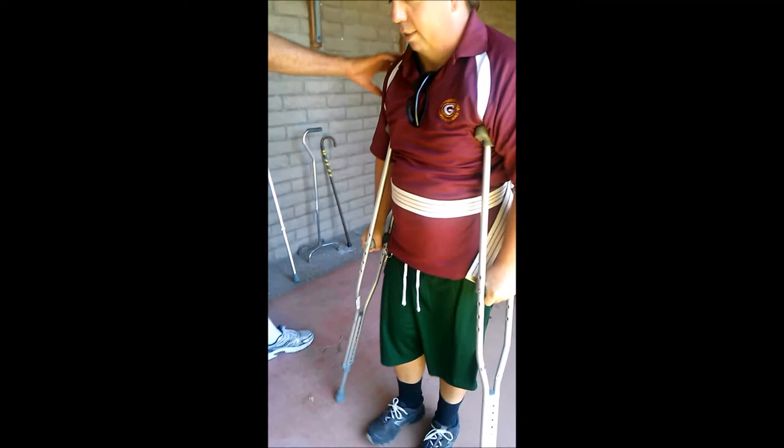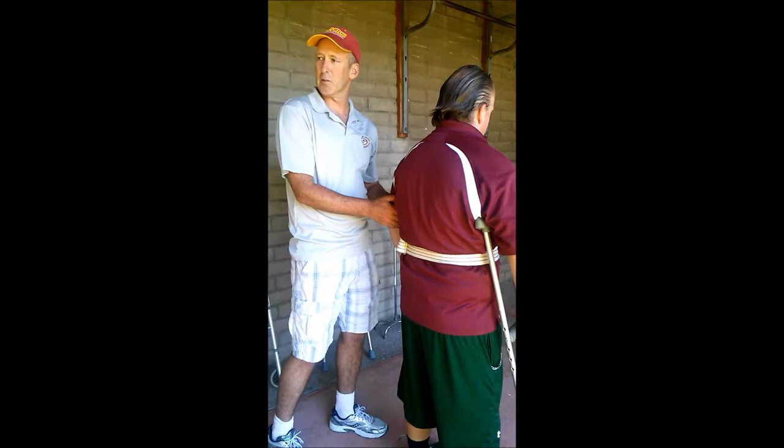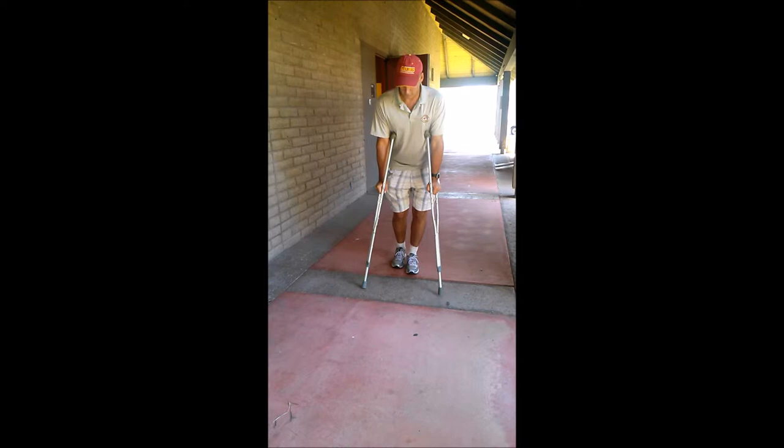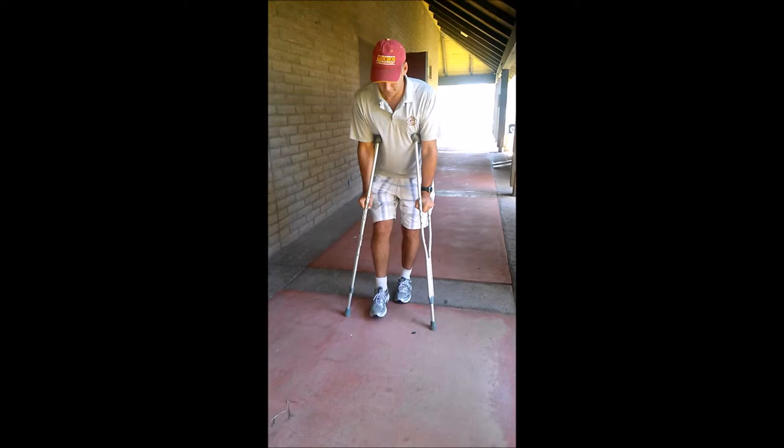Now let's say John is partial weight bearing. I'll give a demonstration - if I'm partial weight bearing on my right foot, I come here and see how when I lift on my left foot, I'm using my arm to bring that forward. I'm forward with the crutch down here, and I'm just barely touching down on that right leg. I could also go with the swing-through - these crutches are painfully short for me right now.